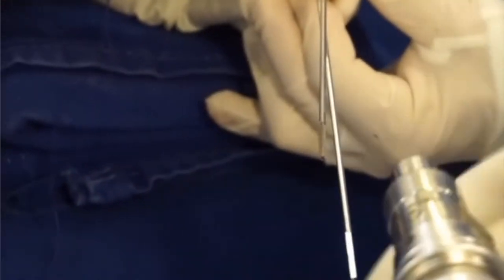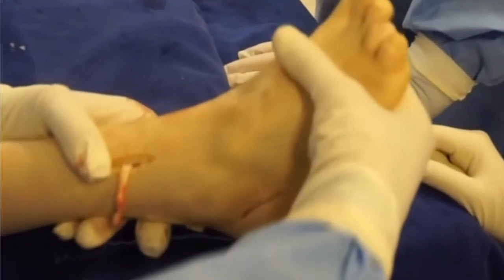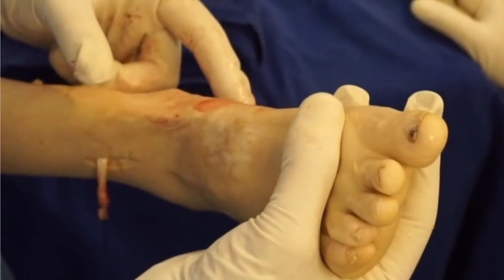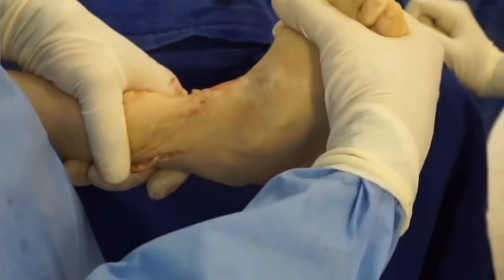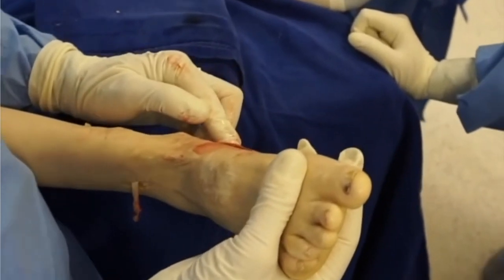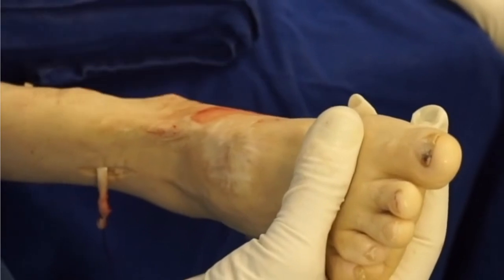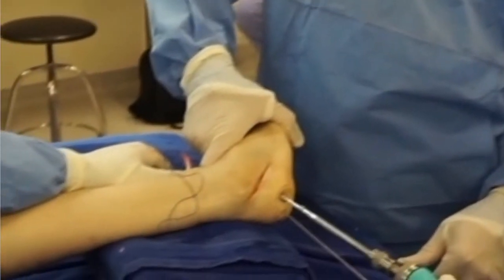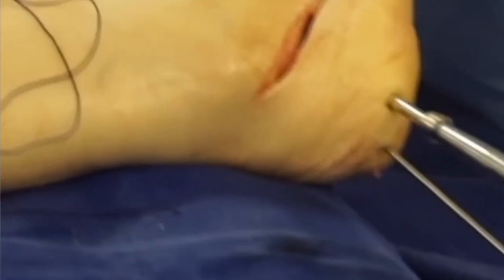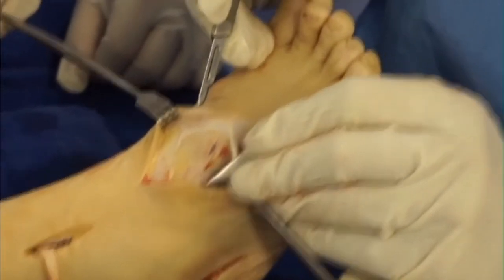Both pins are then inserted, and I like to use two screws when taking out a large wedge from the calcaneus. Before putting my screws in, I want to make sure I don't have a very tight tarsal tunnel. If you take out an excessive wedge, you run the risk of putting tension on your tibial nerve and creating tarsal tunnel syndrome. So palpate the soft tissue medially and make sure that you've corrected the varus. Here we'll put the screws in — and you'll see that we've completely corrected that hind foot varus deformity with the soft tissue release medially and the tendon transfer.